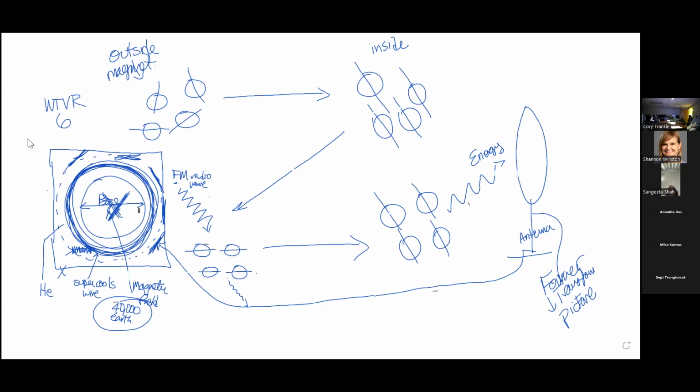So it's kind of nice if you're coming back and you've got a research study or you've got patients and you're following them longitudinally over time. This process does not use ionizing radiation for X-rays. Now, you hear about this thing called, it gets scary, right? There's T1 and there's something called T2, right? We hear about T1 and T2 and all these things. So what do those refer to?